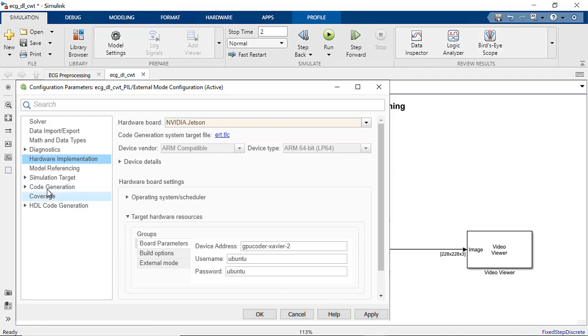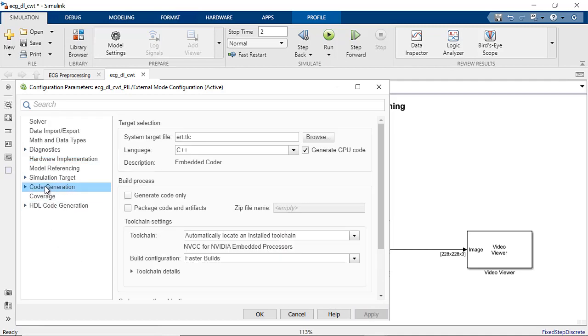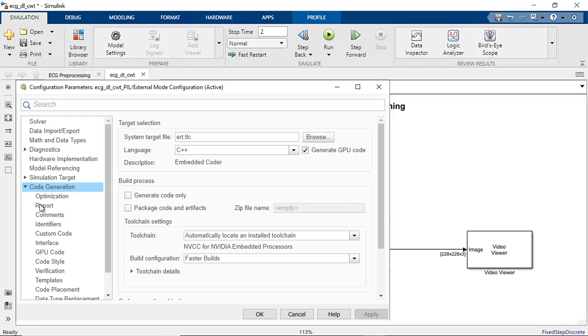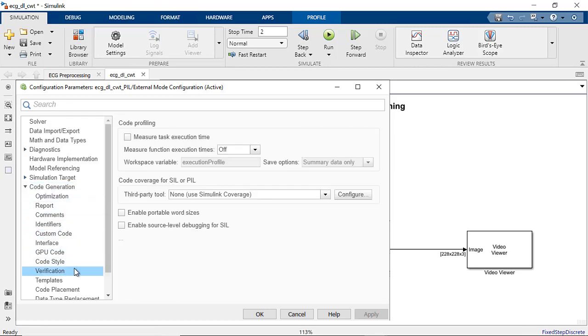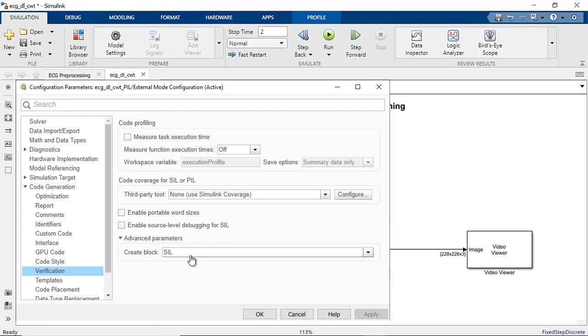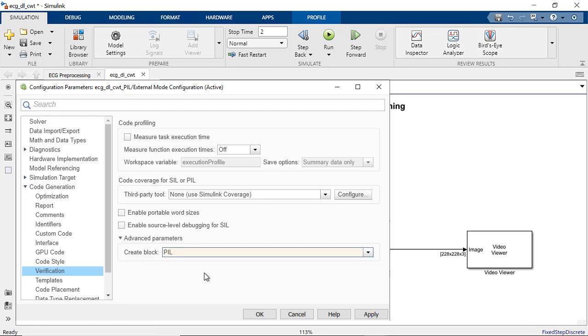To create a PIL block that contains the generated target CUDA code, navigate to Verification tab under Code Generation Settings. Under Advanced Parameters, set the Create Block drop-down to PIL.